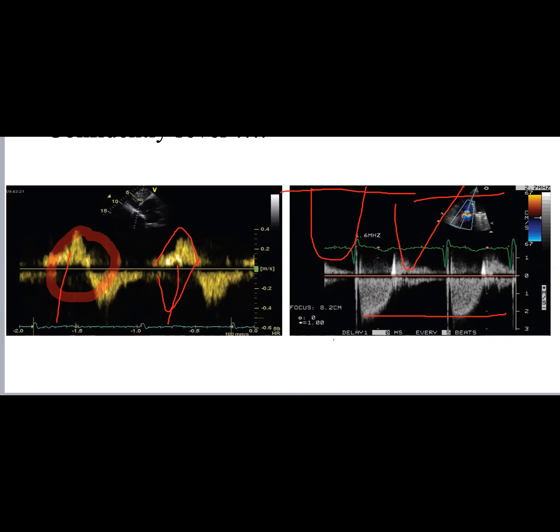No. Because if it is a torrential TR, the valve is fixed open, and you get underestimation of pulmonary hypertension. Very good. So this is a problem I meet a lot with our technicians when they do the echo and see a torrential TR, and when they interrogate it, the peak velocity is not high, and they come back to me asking how come. It is rational. The more severe the TR, the more it tends to decrease the peak velocity of the TR.